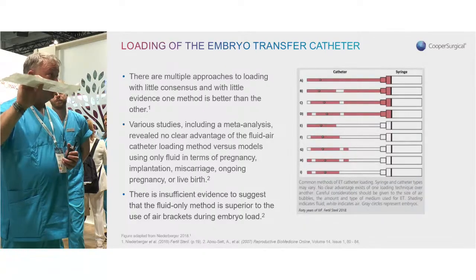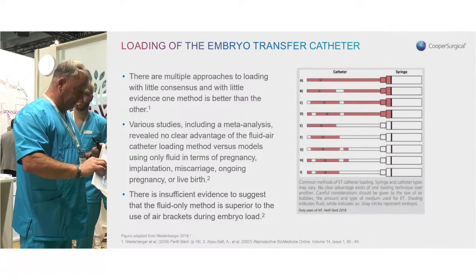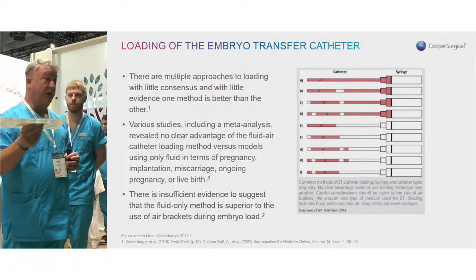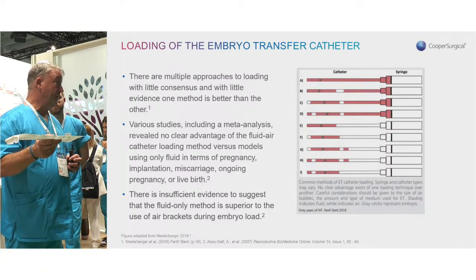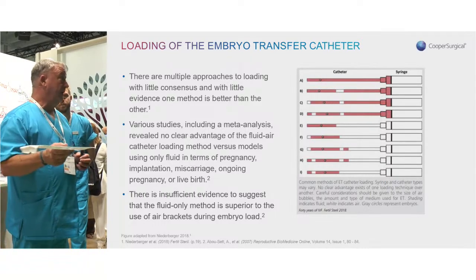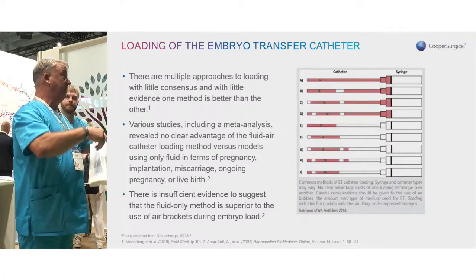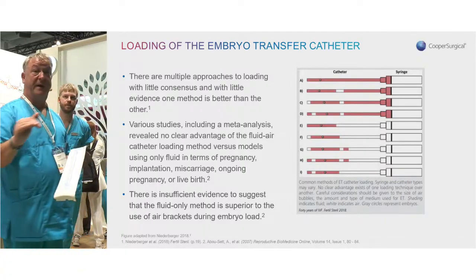The packaging was not designed to be warmed up. Around the edges where the two sides of the pack are introduced, there's glue here. And if you warm that up in your lab, you're very likely to introduce VOCs into the lab itself. Okay? Also, it has no real practical benefit, because once you've heated this up, you take it to your workstation, you open the packaging, all the temperature that you put in is lost. So you're introducing a risk for no benefit.